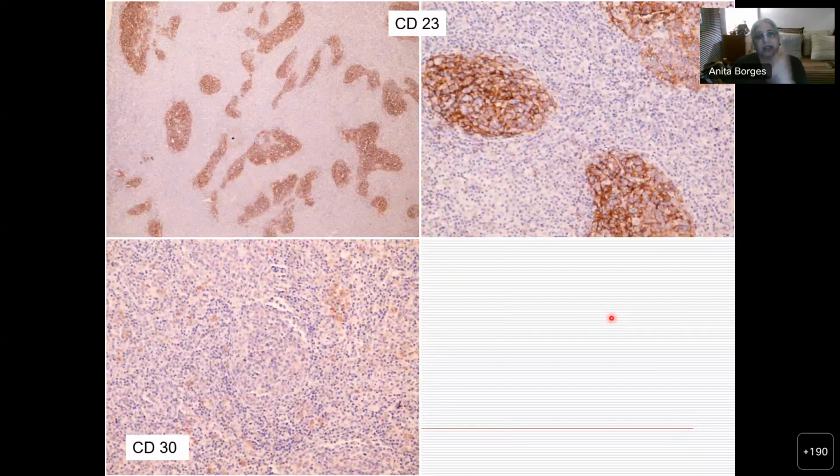You want to find out whether these are actually forming follicles, and the answer is yes. It's a very higgledy-piggledy formation. They are all odd-shaped follicles. They are B cell follicles, but very oddly shaped. And we know that they all have B cells in them.